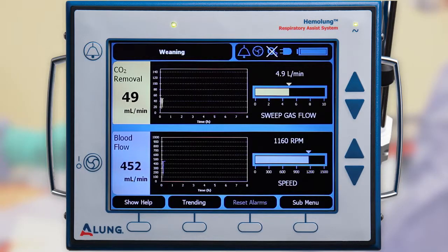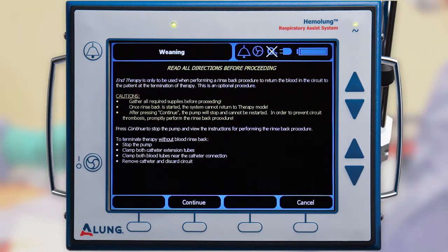To end therapy and enter rinse back mode, press Submenu followed by End Therapy. Once rinse back mode is entered, the pump will stop and cannot be restarted without power cycling the controller. Press Continue to proceed.